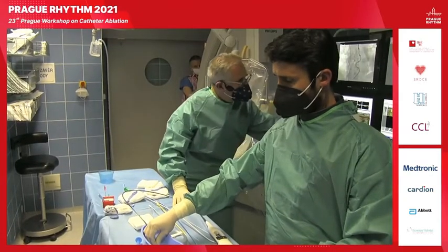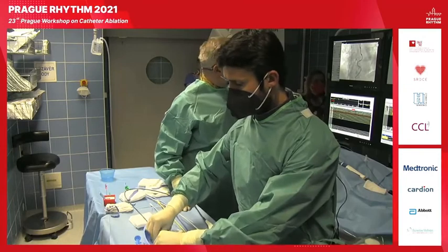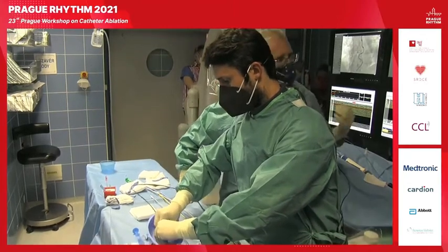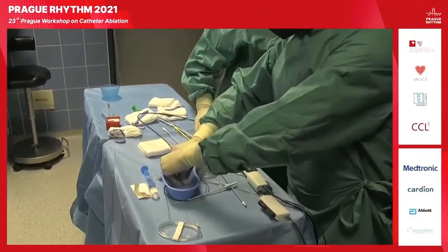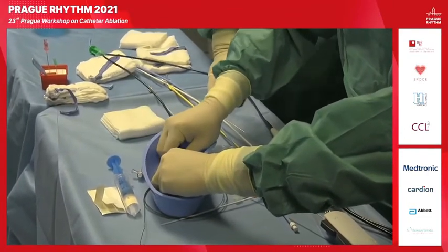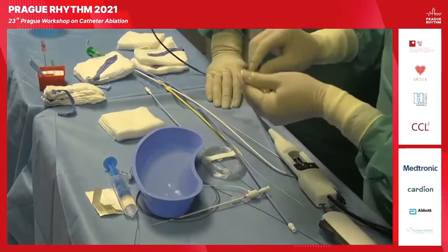So what we did up to now: we can show you what we did in actually regular distribution, regular anatomy of this patient. We have CT done, but I don't want to show you because I really want to be focused only on this visualization. You might know that the system is equipped with a 2 French endoscope. This is a high quality endoscope which allows you to adapt the positioning up to your contact, to adapt the sizing of the balloon, and what is more important, you can adapt the laser beam orientation in concert with the phrenic nerve and with the esophagus.